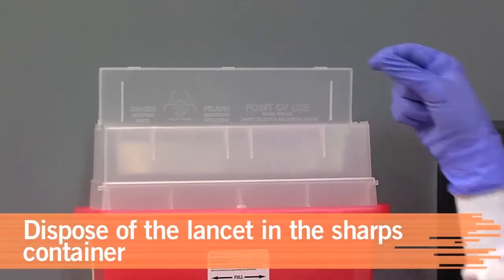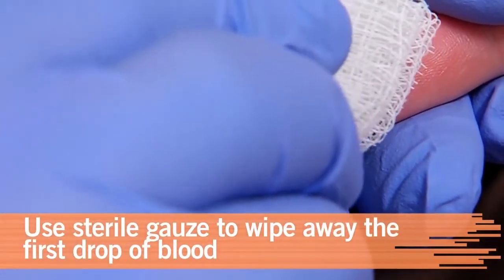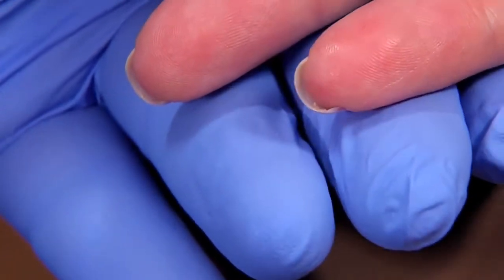Next, dispose of the lancet in the sharps container. With clean, sterile gauze, wipe away the first drop of blood. It contains tissue fluid, which may alter the test results.